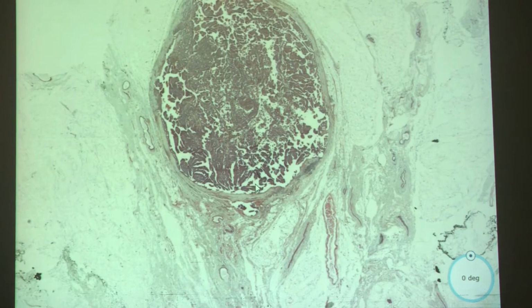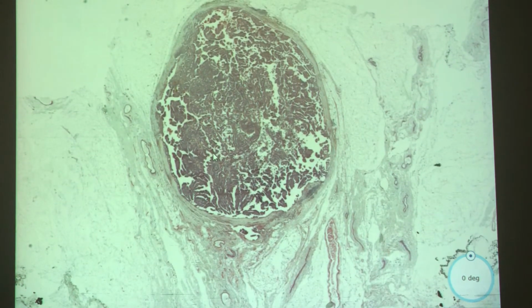That's very interesting. I don't think I've ever seen one of these before. That's great because these are also rare. But yeah, that's excellent. I'm just saying we are in Cleveland, so what's rare is not rare here. That's true. We could get a few of them next week. You never know. And they always come in two. Yeah, or more.